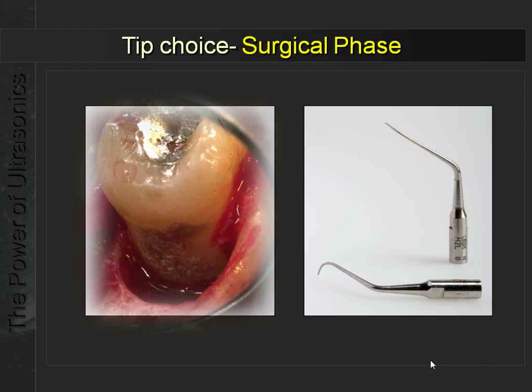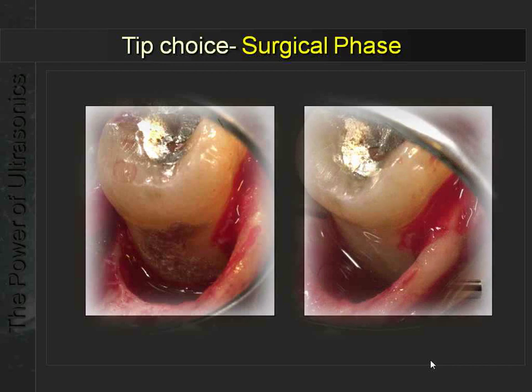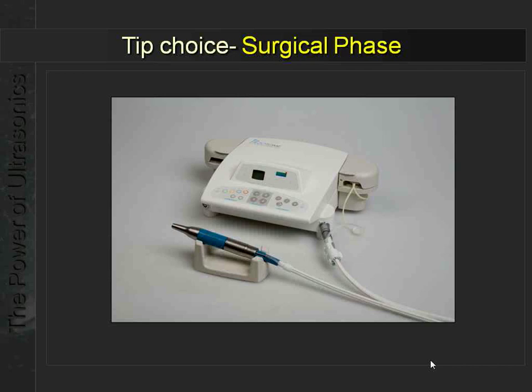Just an example, this is a distal of a last molar. My hygienist did her ultimate best to clean this, but sometimes it's very difficult. Can you imagine that I should have to clean this as well with hand instruments? I'd be working a long time on this as well. So having these diamond-coated instruments, it's very easy to clean it, and this looks nice and shiny, and I really love this as a periodontist.